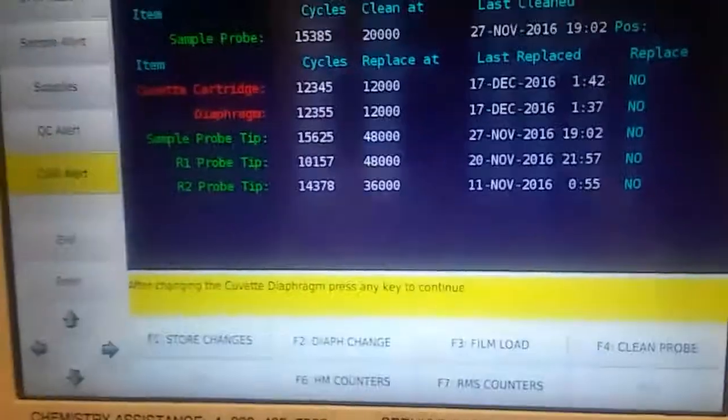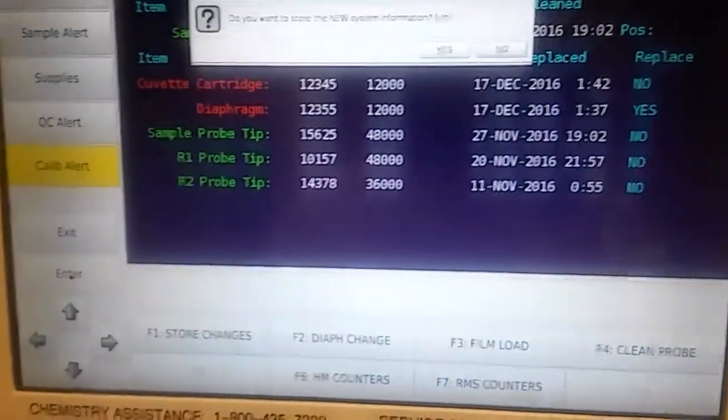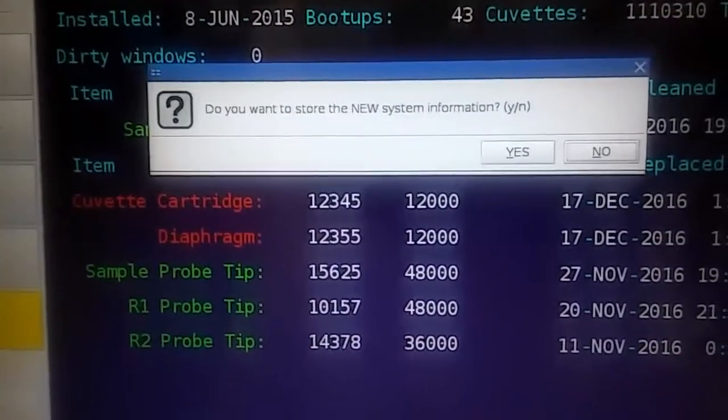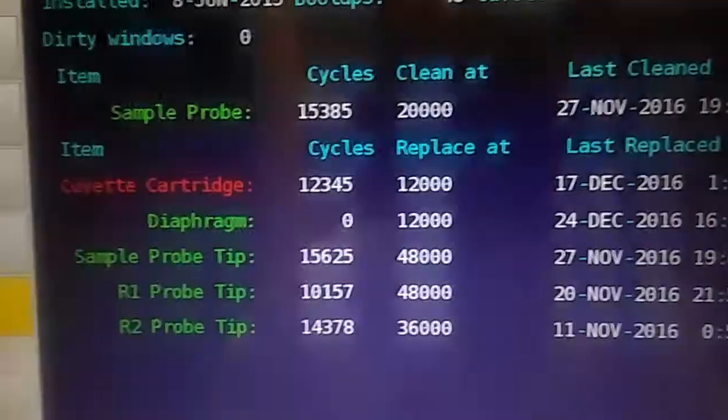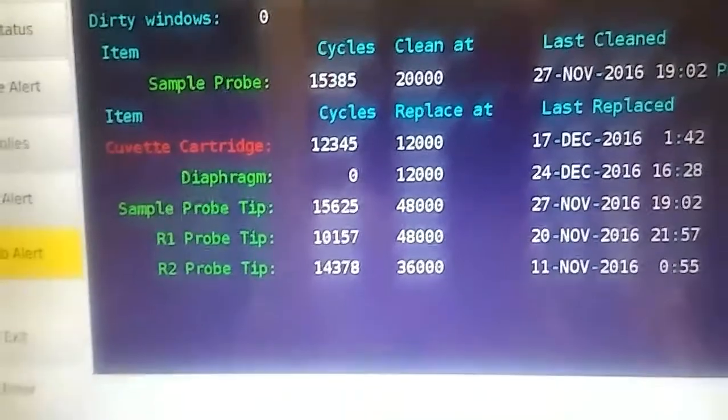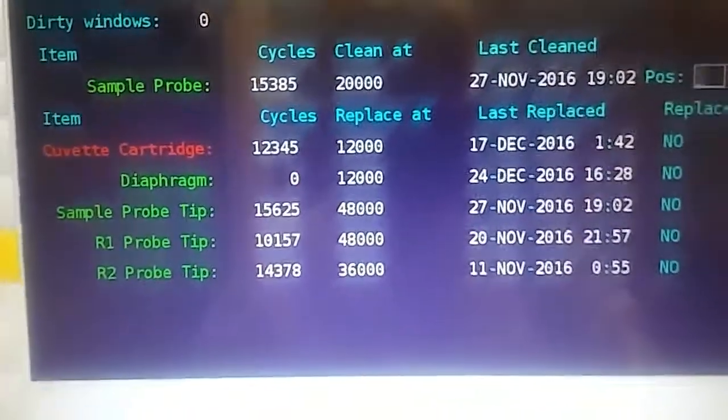Press any key. It says do you want to store the new information — hit Y or click yes. That's the diaphragm change. I already changed the cuvette.